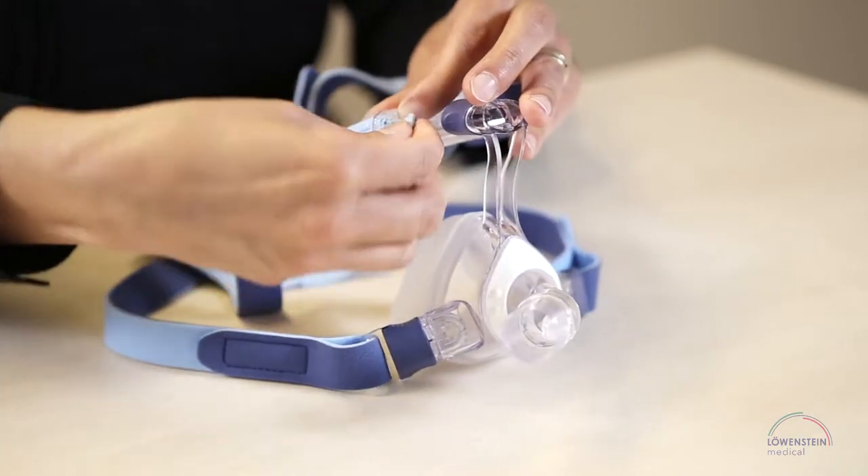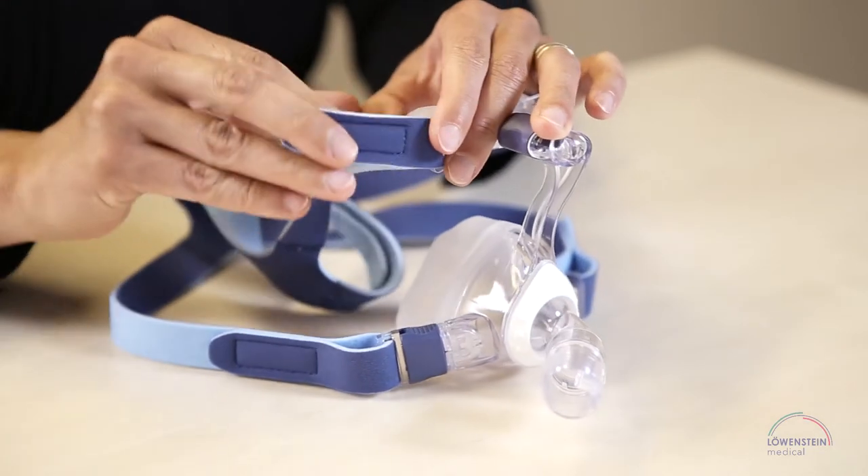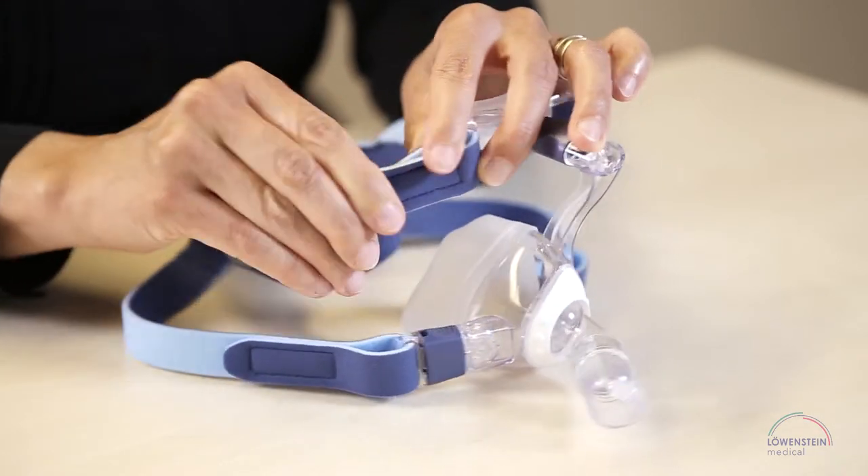Now that the height of the forehead support has been reduced, the mask can be adjusted to the patient's face.